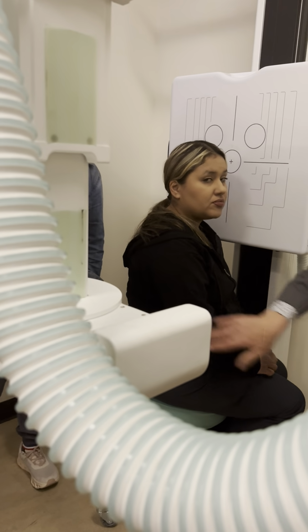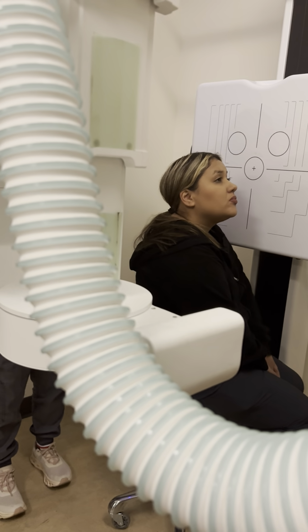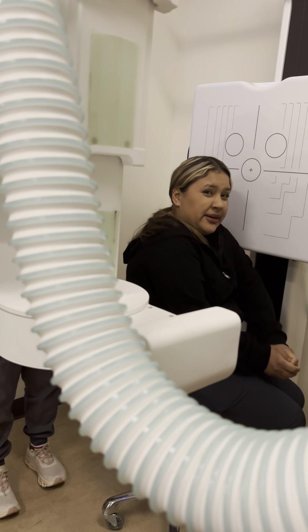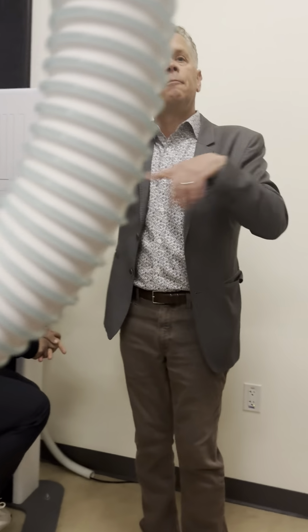You said the bottom, so it would need to be like right here. This is the external acoustic meatus. This is the hole that we use for most of our projections in all skull, facial work, and sinuses work.